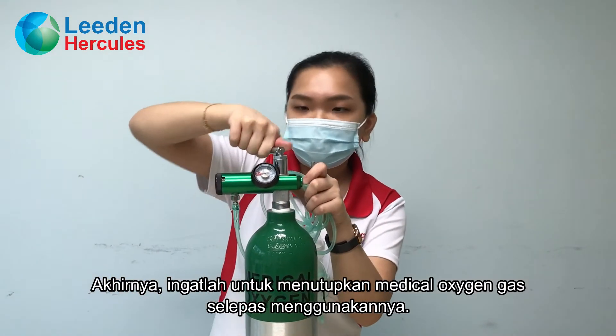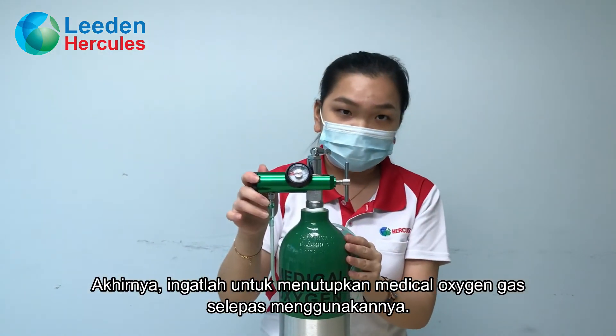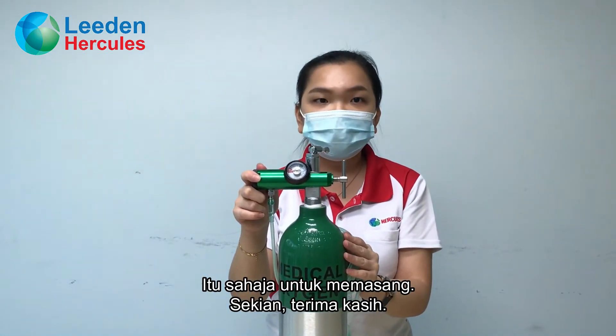Finally, turn off the medical oxygen gas after using it. That's all for the installation. Thank you.